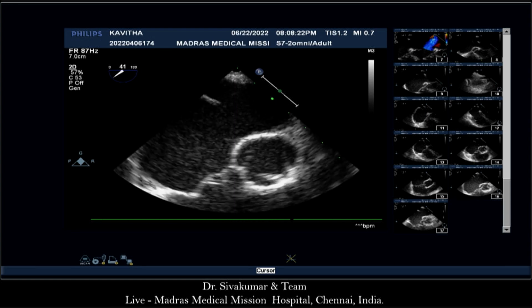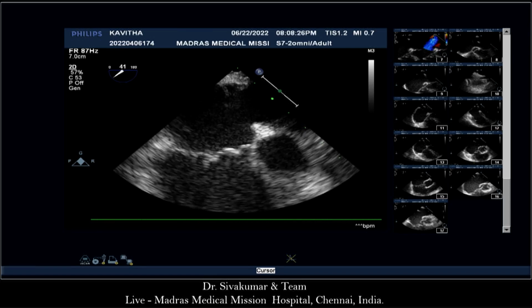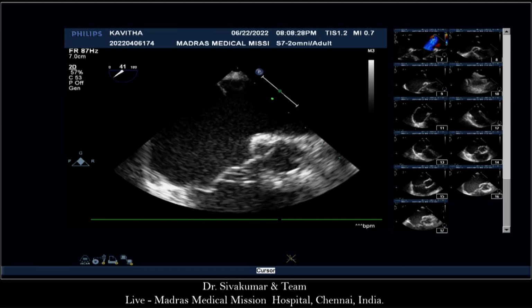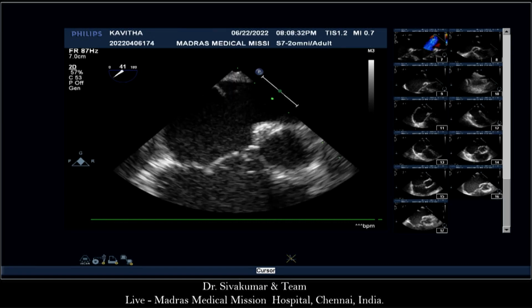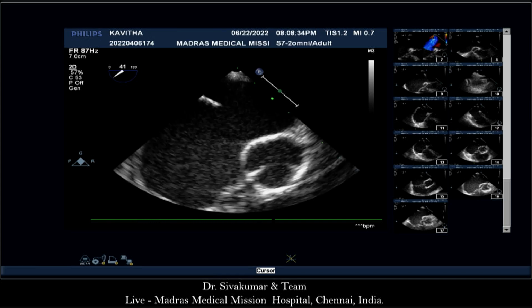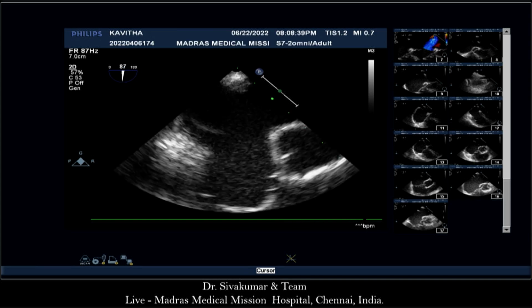Okay, keep going inside, Srija. Yes, I'm going in. Keep on going inside. Reform the septum. What is that? This is the actual plane. But when you pull it out, it is going leftward. Come to 90 degree and show. Now you keep rotating rightward.